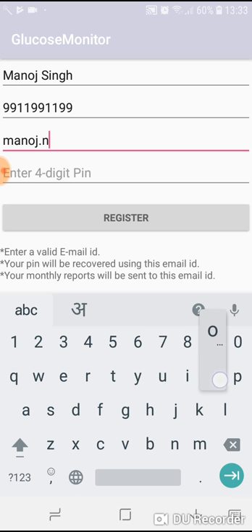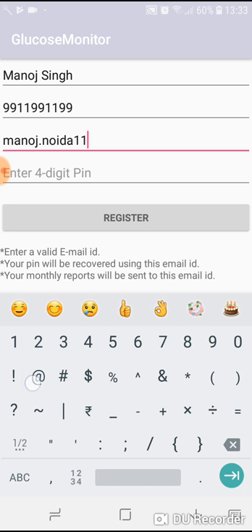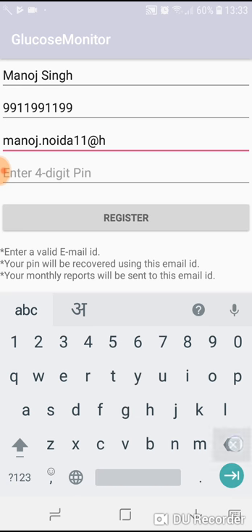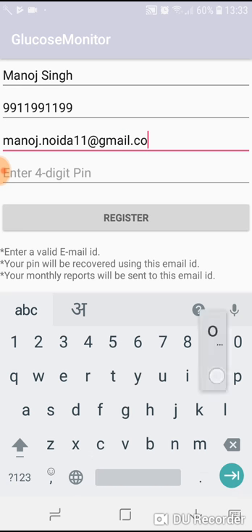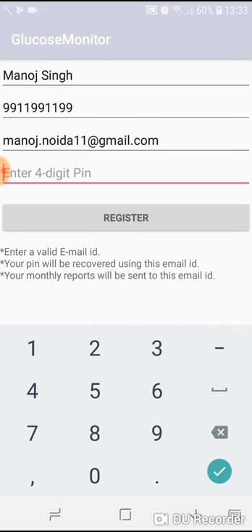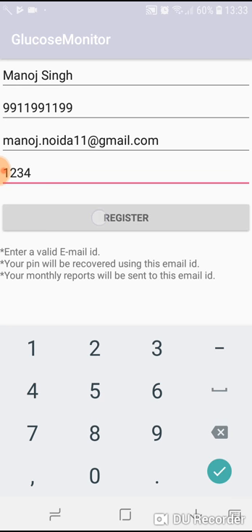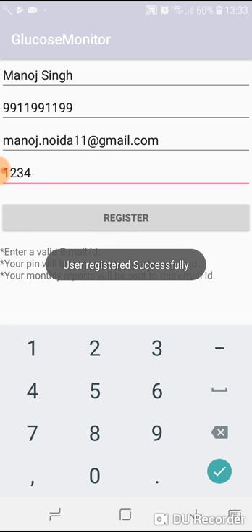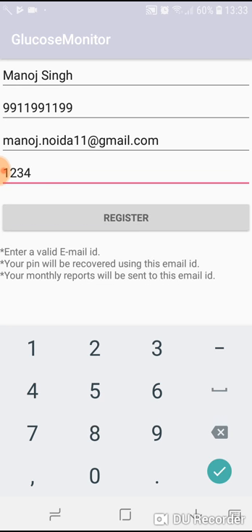One email ID can be registered only once - for a user only one email ID can be used. Let's say pin is 1234. Register. Upon registering you will see the message 'user registered successfully'.